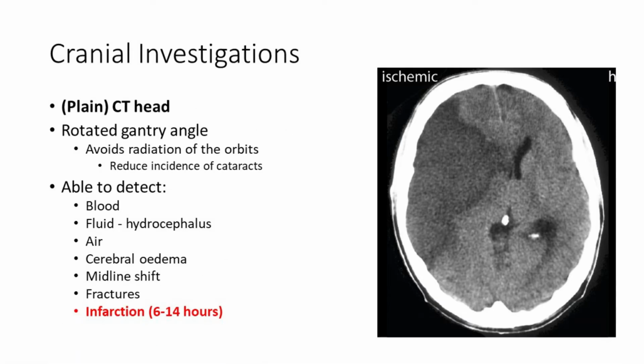And then infarction, don't forget that infarction is shown on CTs, but again only in a delayed fashion of at least 6 to 14 hours. Occasionally it will be earlier than that.